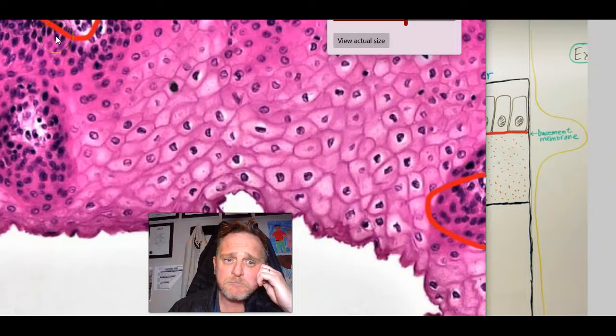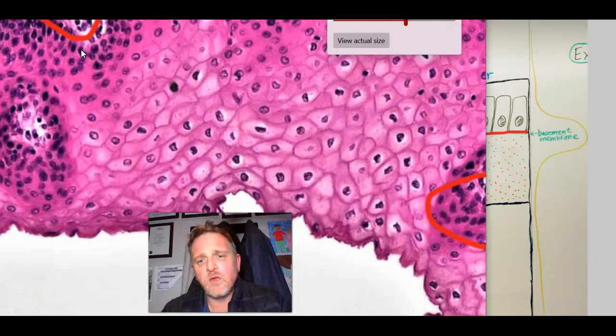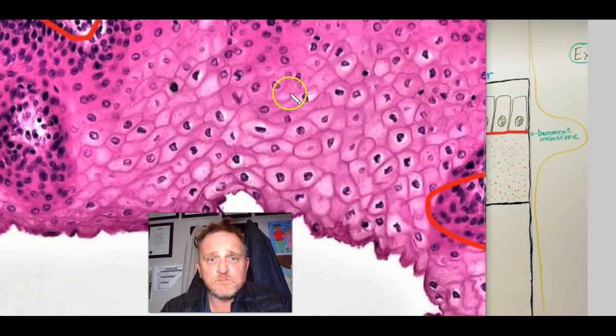As they mature they spread out and become vesicular, so it appears as if there's vesicles inside the nucleus, but that's not the case. It's just a spread out DNA pattern. This is because the DNA is dense and there is rapid division.